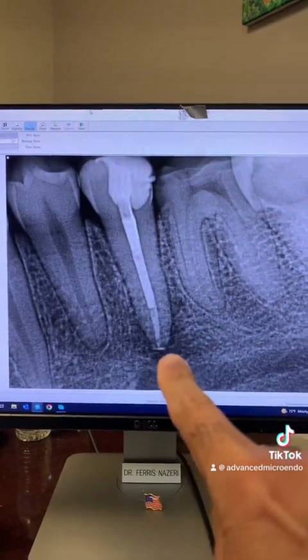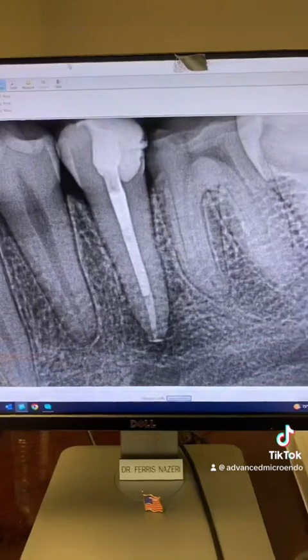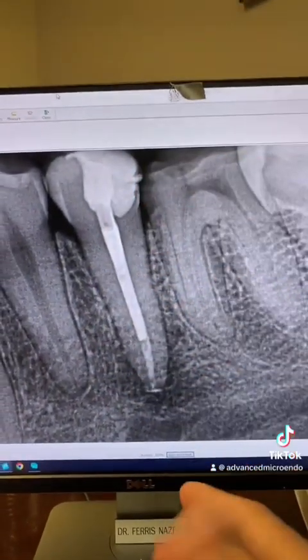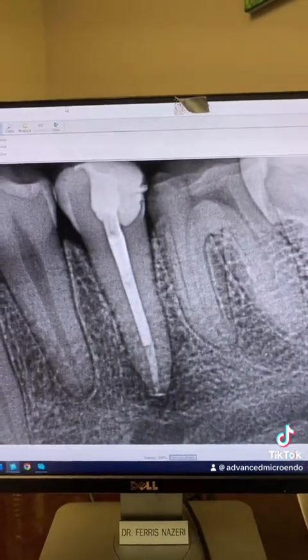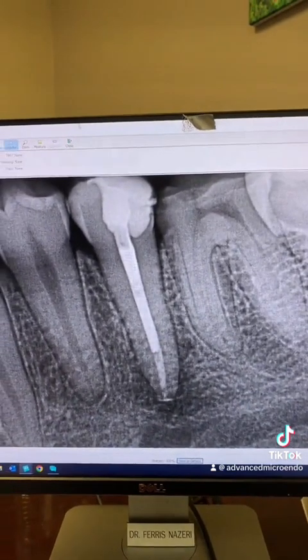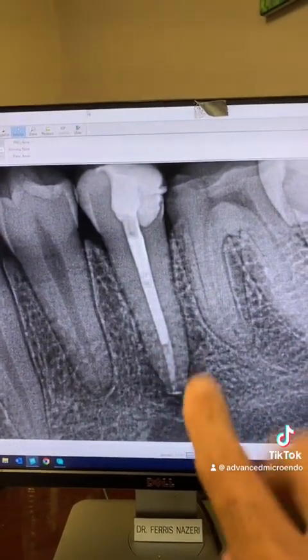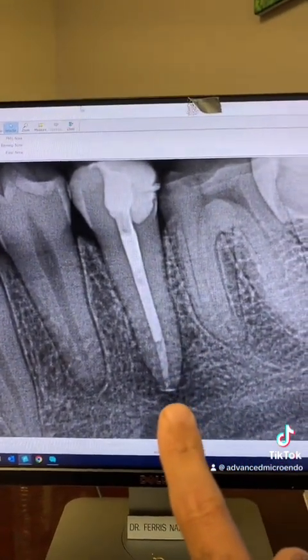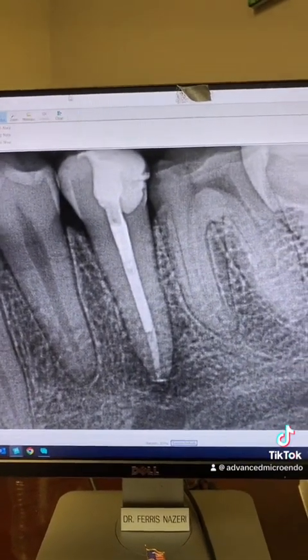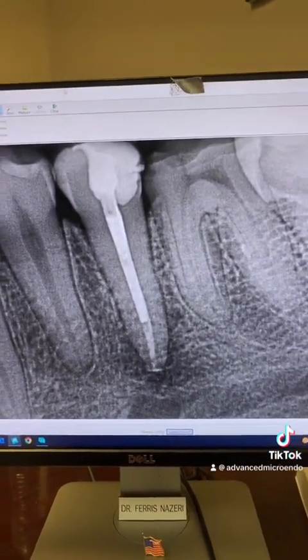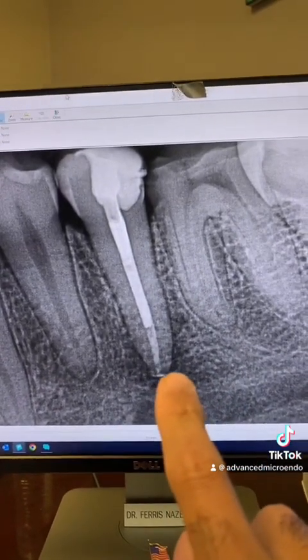I placed an MTA plug followed by gutta-percha and sealer, completing treatment in one appointment. Some of you have asked why I use an MTA plug. My rule of thumb is when the apical diameter is 50 or more, I use an MTA plug because it gives me a better apical seal compared to gutta-percha and sealer alone.